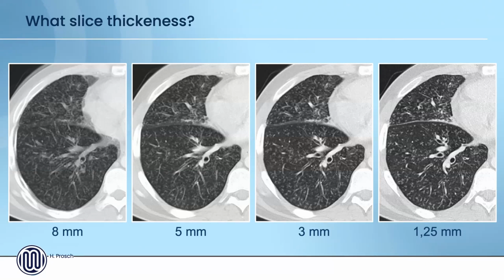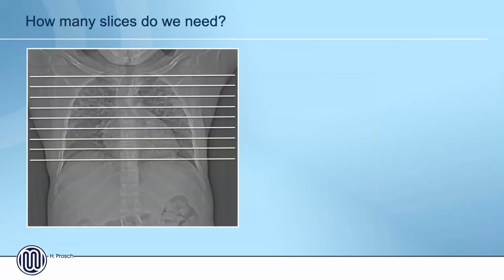So it's important to start right off with the appropriate imaging technique. What about HRCT as a term? The classical term of HRCT refers to a CT examination which was invented back in the 80s of the last century. Back in the days, the scanners were not able to scan a whole body in the few seconds we are doing right now, but had to perform slice after slice to cool down the system.